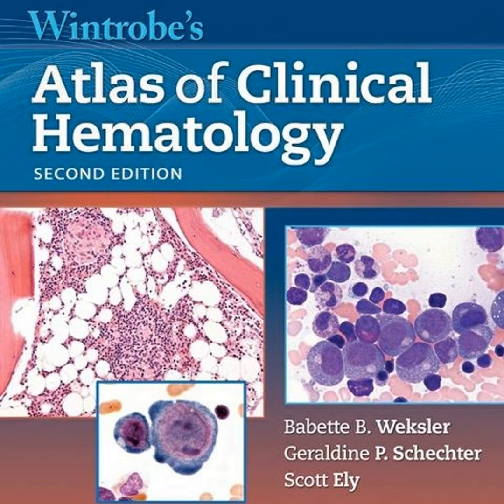It all connects. So after checking the general color, the systematic slide exam begins. And the Atlas really stresses starting at low power, 10x or 20x. Why start low? You need that bird's eye view first. You're checking the overall quality, looking for staining artifacts, making sure the cells are spread evenly. And you're looking for that sweet spot on the slide. Critically, yes. You're hunting for the optimal thin area. You want the red blood cells, the RBCs, to be in a single layer. They should be close, but not overlapping, and you need to see that normal central pallor. Because if you're in an area that's too thick, you'll misread everything. You might misclassify spherocytes, or you could totally miss crucial fragments. It all starts with finding the right real estate on the slide.